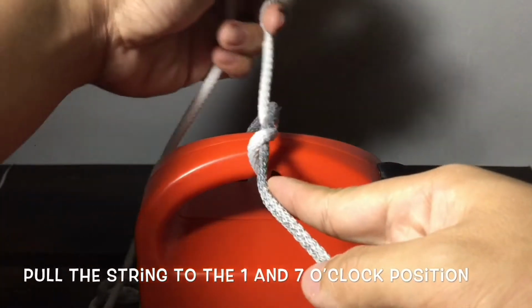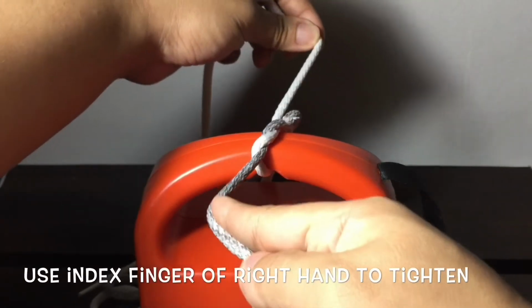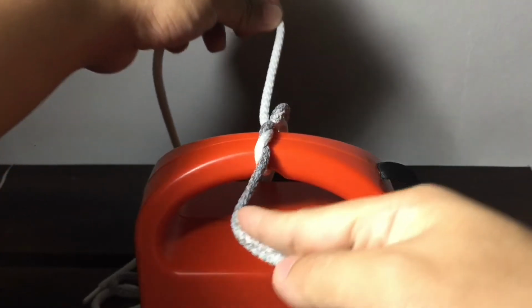Hook the white string with your left middle finger. Pull the string to the 1 o'clock and 7 o'clock position. Use your right index finger to tighten the knot. Remember that after the first throw, your hand should be left over right with your left hand holding the farther string and right hand holding the nearer string.